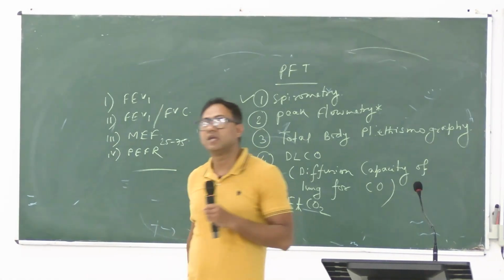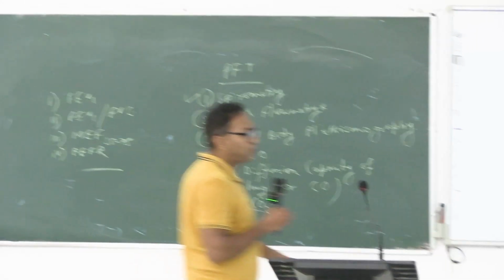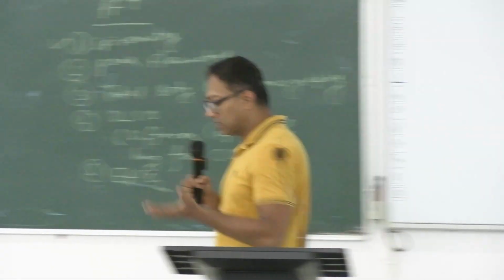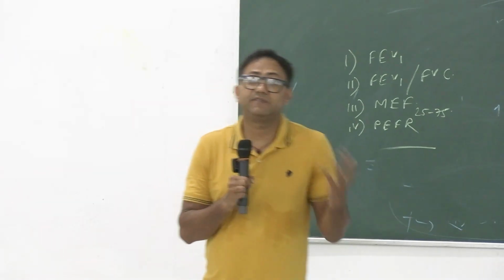Now can you tell me what are the lung volumes that cannot be measured by spirometry? Yes, the answer is residual volume and total lung capacity. We cannot measure residual volume and total lung capacity with the help of basic spirometry. We need other investigations for that.